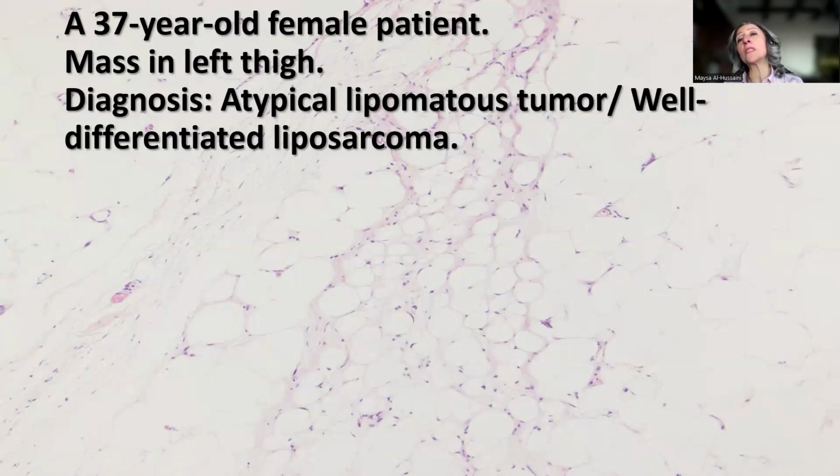And remember, while MDM2 immunohistochemistry can be helpful in supporting the diagnosis, you really need a more robust type of confirmation for the diagnosis, including FISH testing, for example, with MDM2 amplification, or if you have the resources and access to methylation profiling, then copy number variation can show MDM2 amplification alone, or in the presence of others like the 1Q amplification. I hope you find this tip useful in your daily practice.